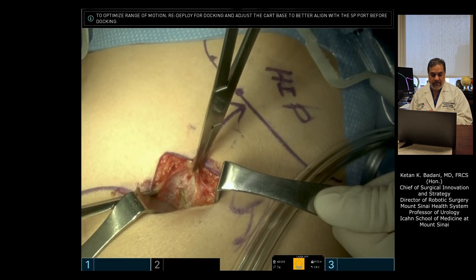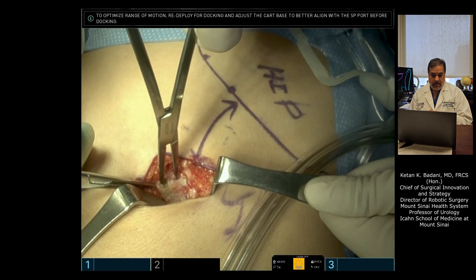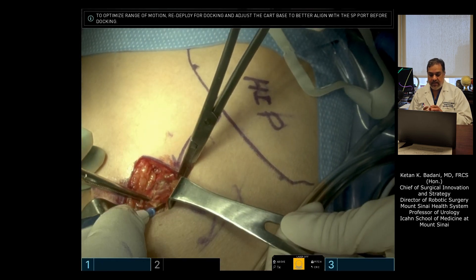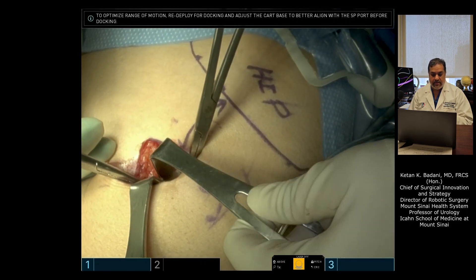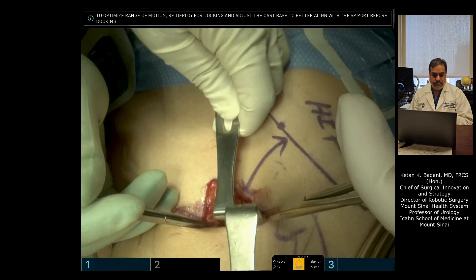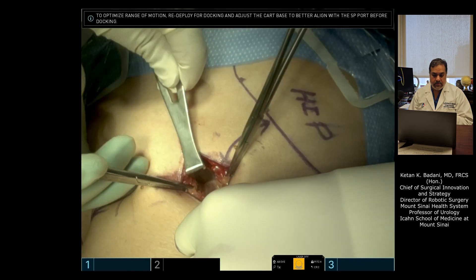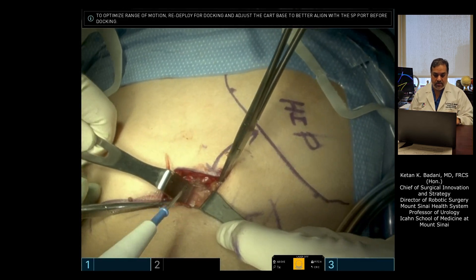This is the internal oblique fascia, the second layer. Grab that and split the muscle. Most of this incision is muscle splitting. Every so often you have to cut a little bit just to release it — you can see the internal fibers. Use retractors to split the muscle apart: S-retractors, Army-Navies, whatever works. Once you split the muscle apart, you want to have about three centimeters of space for all the ports to go in.